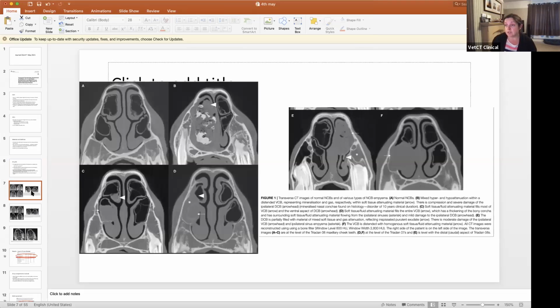So these were just a few images of what they were looking at. This is a normal nasal conchobulla. They described this one as an enlarged ventral conchobulla causing compression of the dorsal. From that image myself, I think it's just stuff in the region, but I assume if you follow it backwards and forwards, you can probably determine which is which.